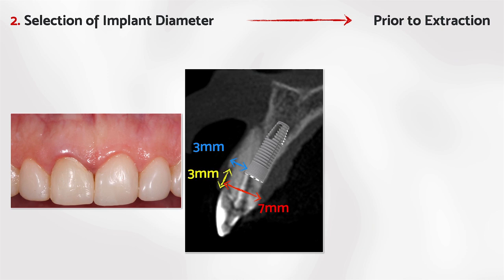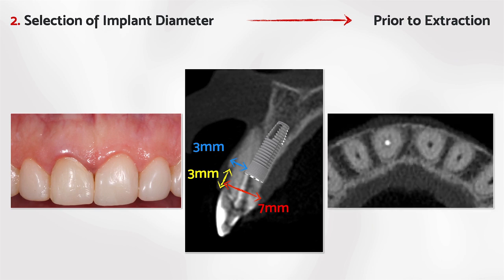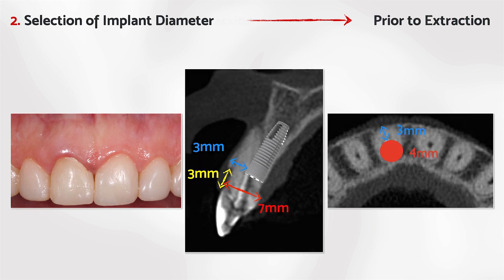And the ideal position of this implant in the coronal-apical direction should respect this protocol. The implant has to be placed 3 millimeters from the gingival margin in the apical direction. Through this axial view, I want to call your attention to the right position of the implant, always seeking the palatal wall anchorage. And take a look, not only the diameter of the implant, but the space that we are going to leave between the implant surface and the inner part of soft tissue.